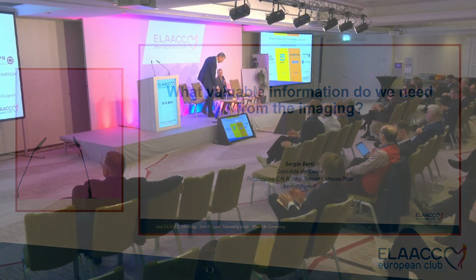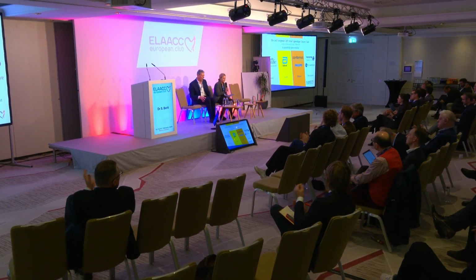Thank you so much, Sergio. So maybe just to get an overview, is somebody just using fluoroscopy during the procedure? If you could raise your hand. Just fluoroscopy. Okay, fluoroscopy in addition to some support. So there's nobody who's just using fluoroscopy.